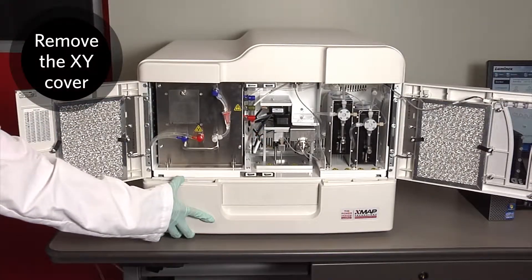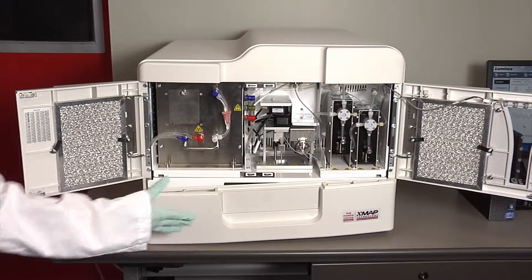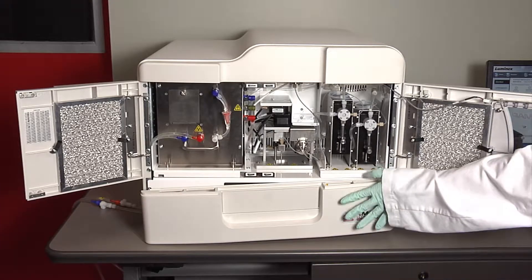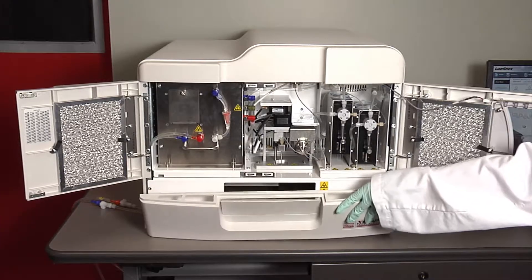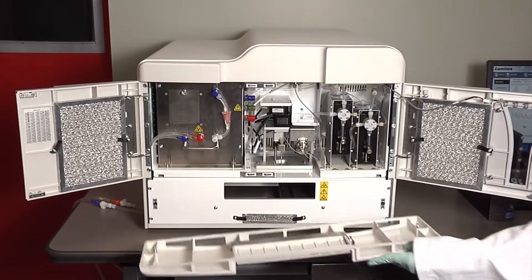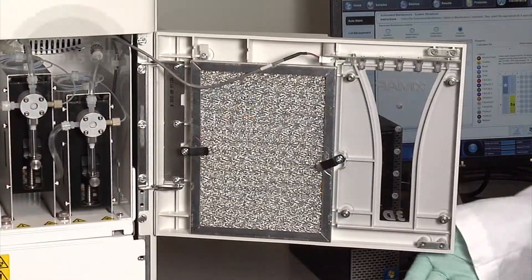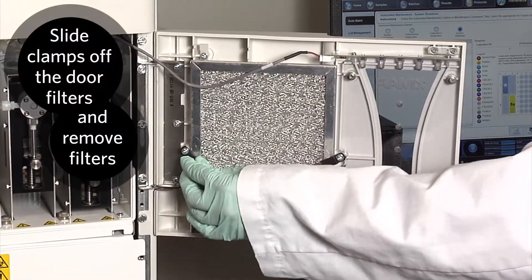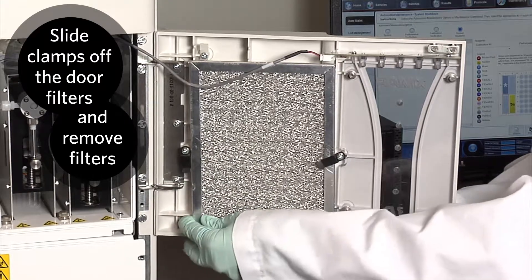Remove the XY cover by gently grasping its ventilation holes and pulling it straight out. Slide clamps off the left and right silver door filters and remove the filters.